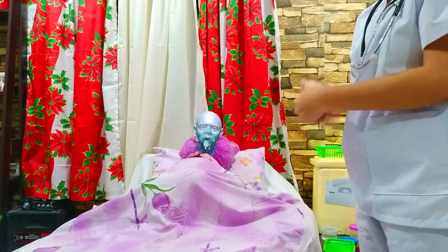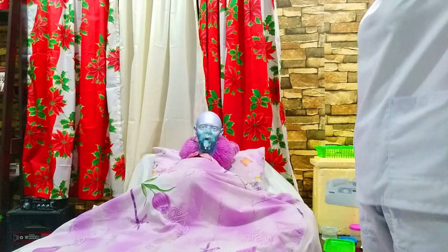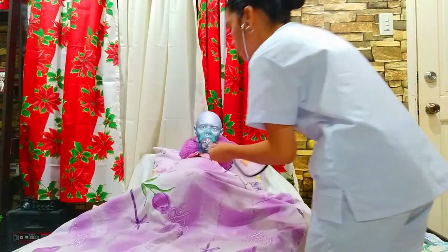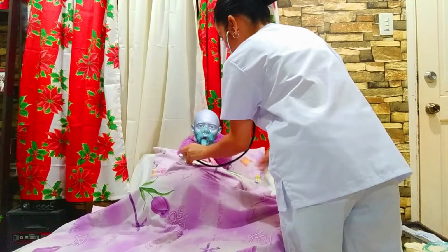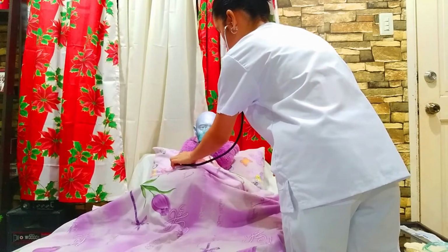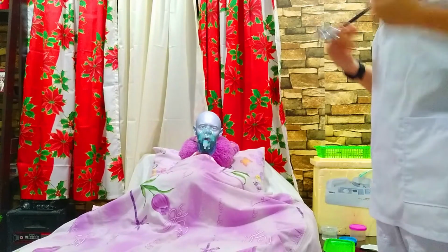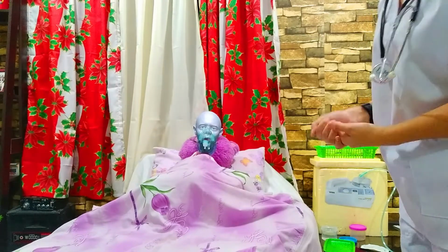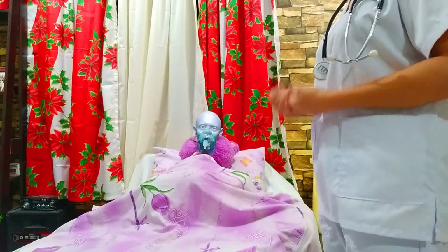And then we need to reassess the patient's respiratory status, including the respiratory rate, effort, oxygen saturation, and lung sounds. And then assist the patient to a comfortable position and ask if they have any questions and thank them for their time. The next is we need to ensure the safety measures when leaving the room.